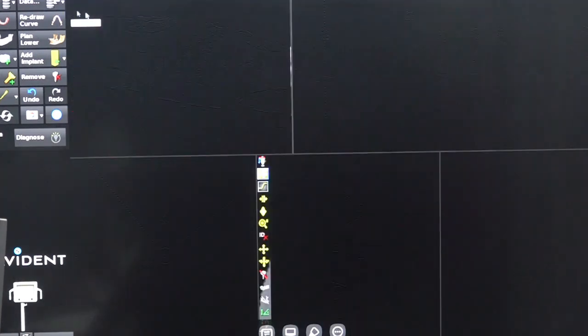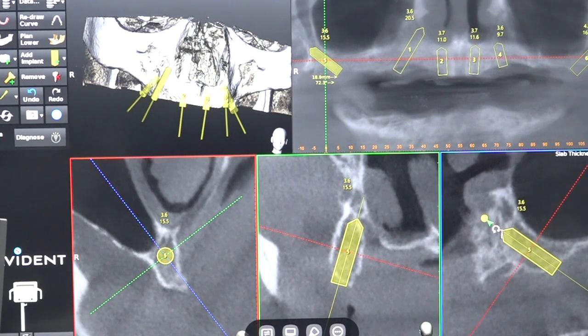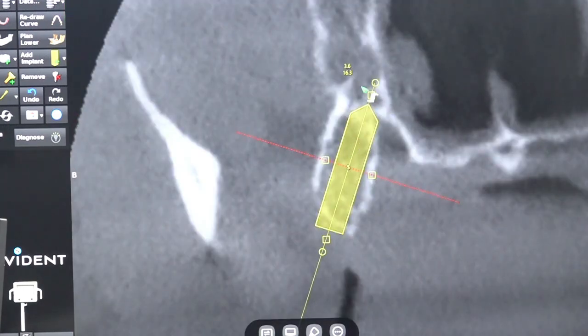This is anatomical variation, because the more distal you are angulating, the less risk you have, but for this patient it is. So now only we could avoid it. Now only we are seeing the lateral pterygoid and the medial pterygoid, and this is the greater palatine foramen.